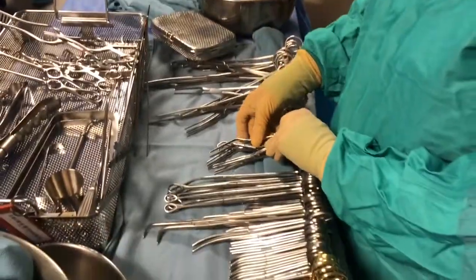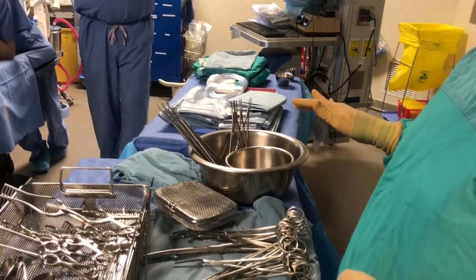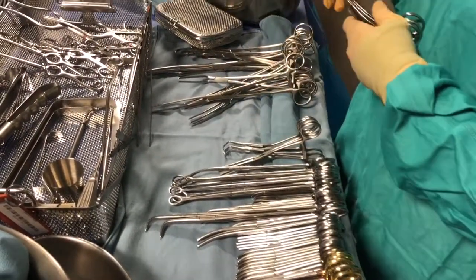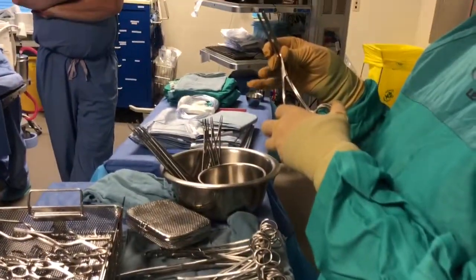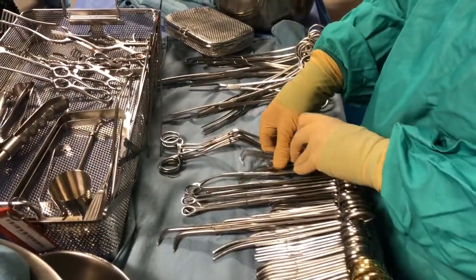Sorry, do you load those before you put them in? No, I actually put them in while I'm doing it, and then once we have counted, then I load them all. So before the surgery starts, you've loaded them. All of them, yeah. So what I find the easiest with something with big instruments like this is I just snap these closed and turn them this way instead of being on my string.